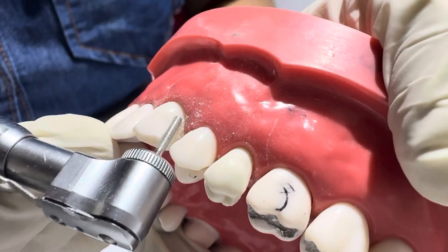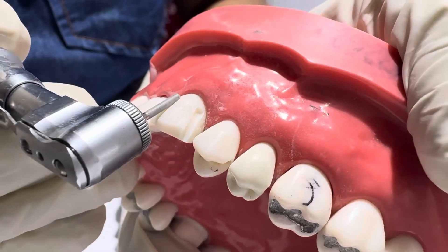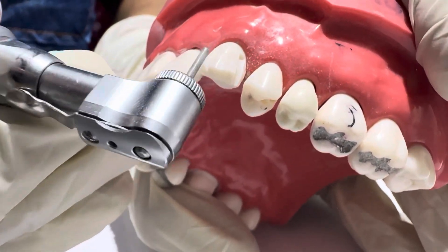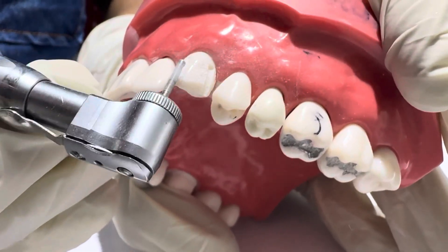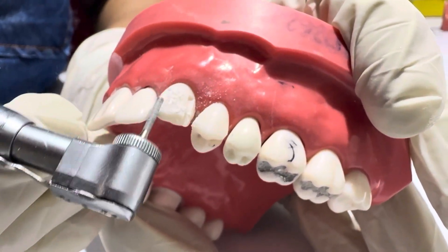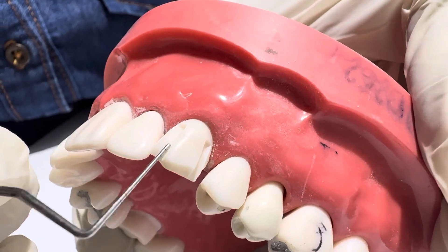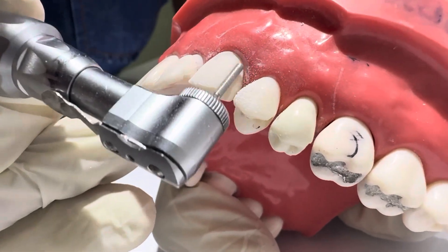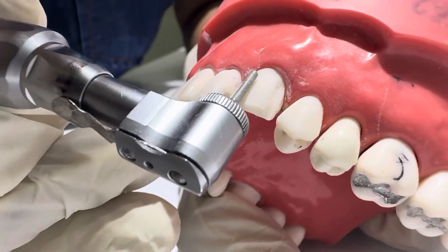Step 4: Labial reduction. Use a round-end tapered diamond burr. Make two depth grooves, 1.0 to 1.2 millimetres, in the cervical and middle thirds, and slightly more in the incisal third for aesthetics — up to 1.5 millimetres if all ceramic. Connect the grooves to reduce the labial surface evenly, ensuring uniform reduction following natural contour.